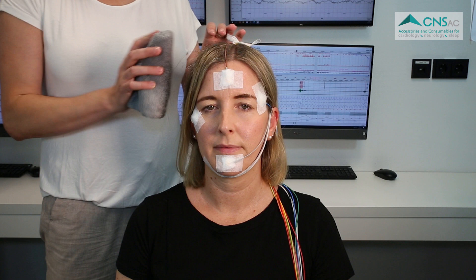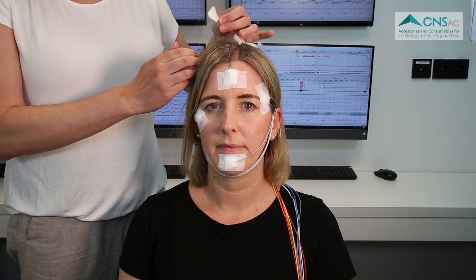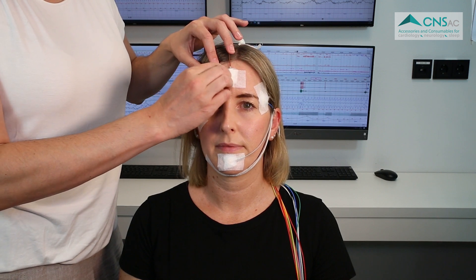At the end of the measurement, which is typically the next morning or after several days during long-term EEG monitoring, use a damp cloth to wet the EEG ACP paste before removing the cup electrodes. EEG ACP is a water-soluble paste and can be easily washed off hair and skin simply with water.